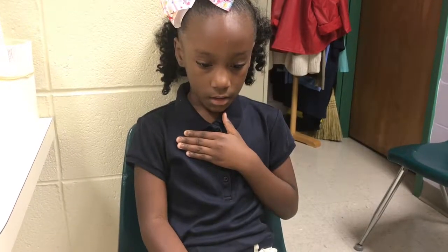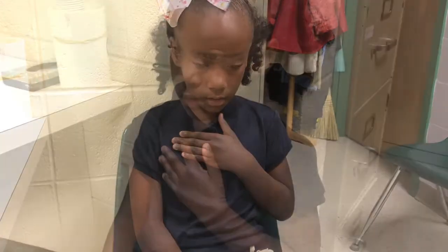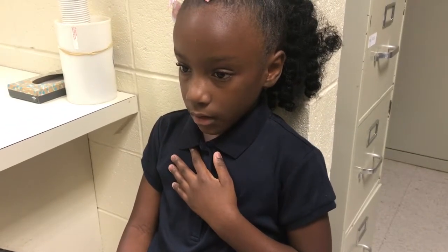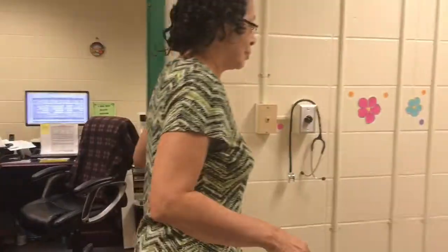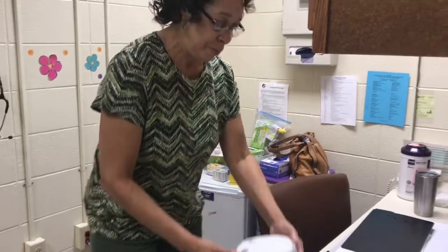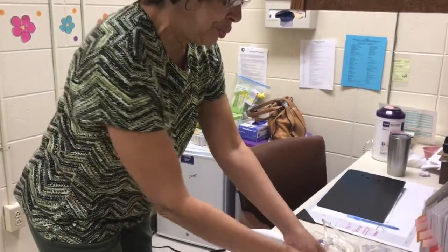It can be very scary to witness a child in respiratory distress. It is important that in each school, all trained members should know exactly where the albuterol medication and the nebulizer machine are. These emergency medications should not be locked away, but placed where all can get to them quickly in an emergency.